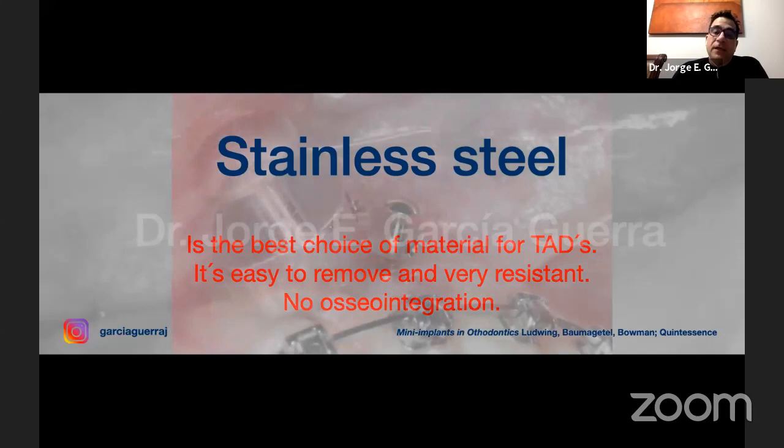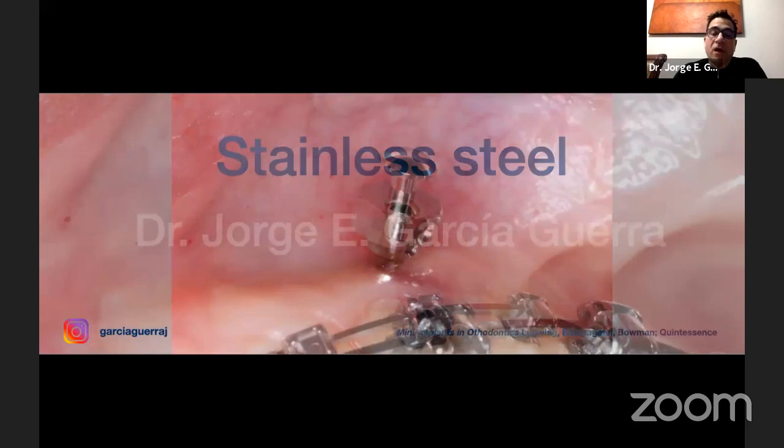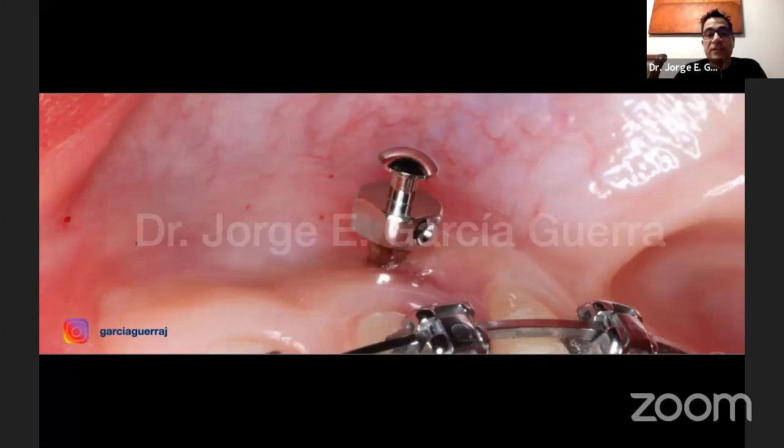Now, this is an example of a placement of the mini implant. We need to understand where we're going to put it, because if our insertion site is not the correct one, we're going to have tissue soreness, tearing of the tissue, and it's going to be more probable to have a failure, okay? So we need to understand what we're going to do there, okay?